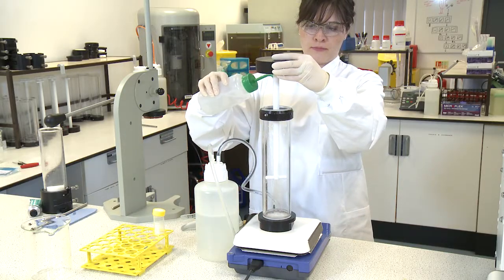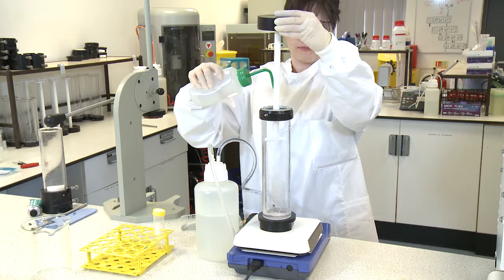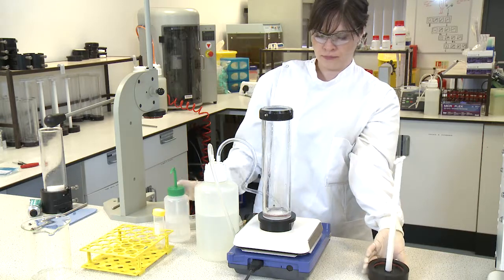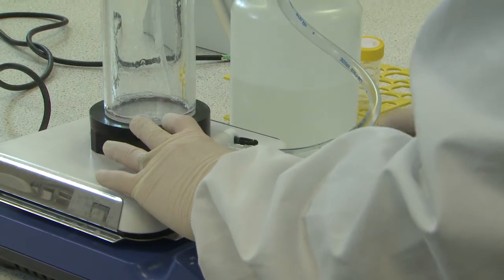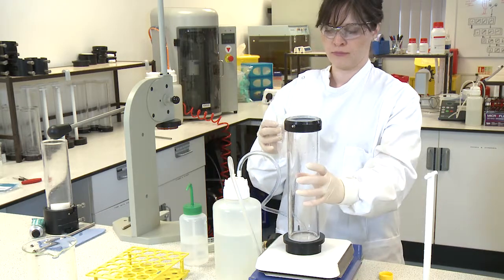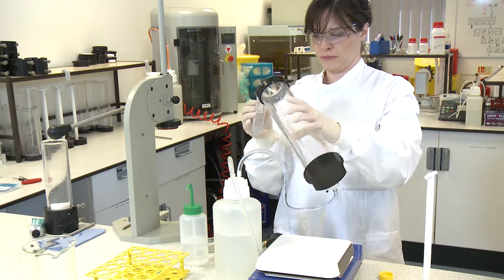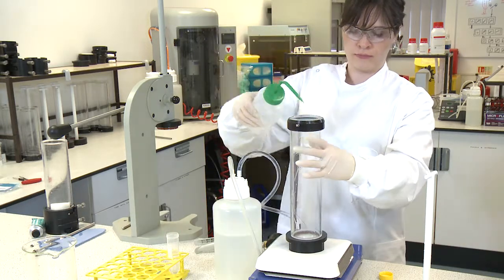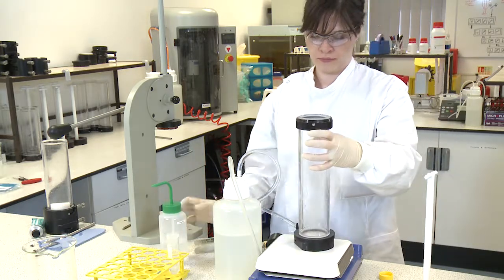Remove the magnetic stirrer bar and rinse with PBST. Open the tap on the concentrator base and drain the eluate level down to approximately 30 millilitres and close the tap. Pour the remaining eluate into a 50 milliliter centrifuge tube. Rinse the inside of the assembled concentrator tube with PBST and add it to the same 50 milliliter centrifuge tube as used earlier.